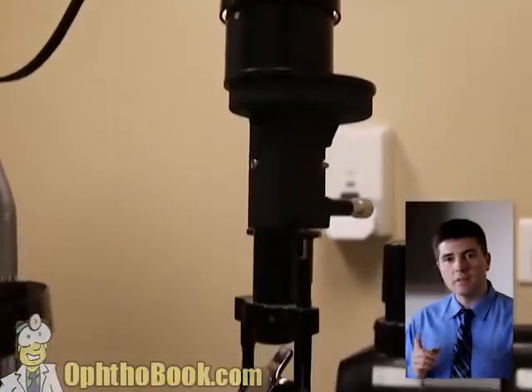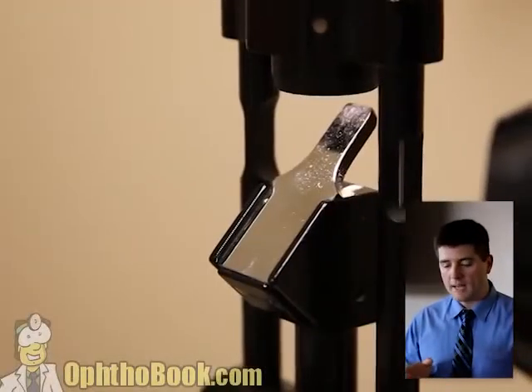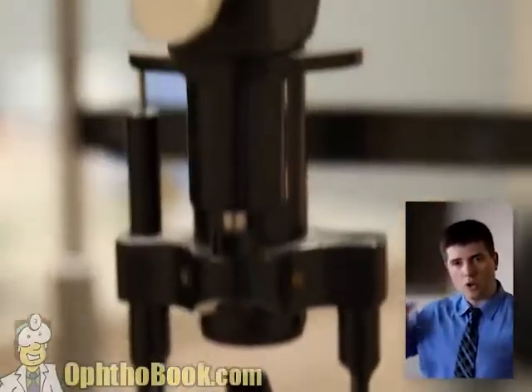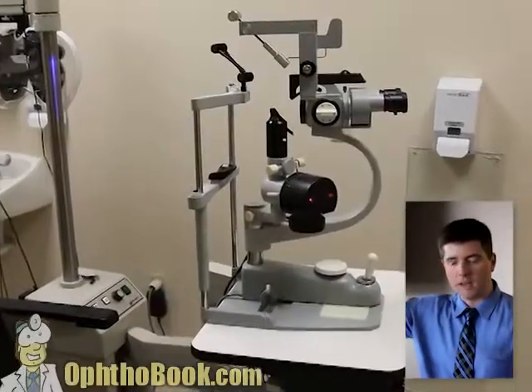The light is above, shoots down through various filters and lenses, and strikes a mirror before hitting the surface of the eye. The only problem I have with this particular model is that the light column is so large and the controls are so spread out that it's a lot of work. You're constantly reaching above your head to use it.